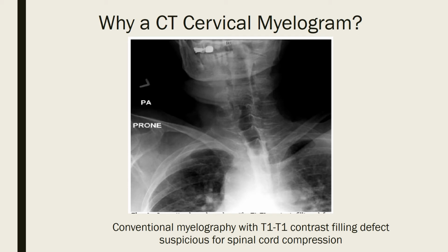This is a picture from her exam. This is done in the X-ray portion with the contrast. This picture shows a T1 contrast filling defect with suspicion for spinal cord compression.